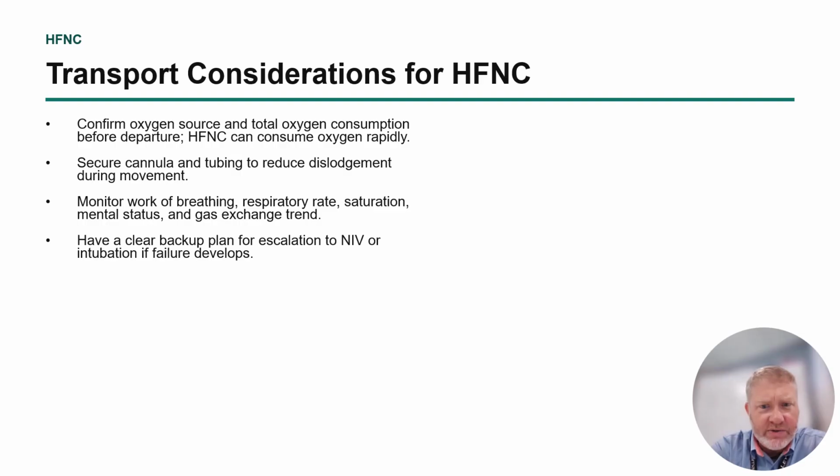Transport considerations for oxygen for high flow. High flow adds some logistics to the whole patient treatment process when you're transporting a patient. First off, it uses a lot of oxygen.